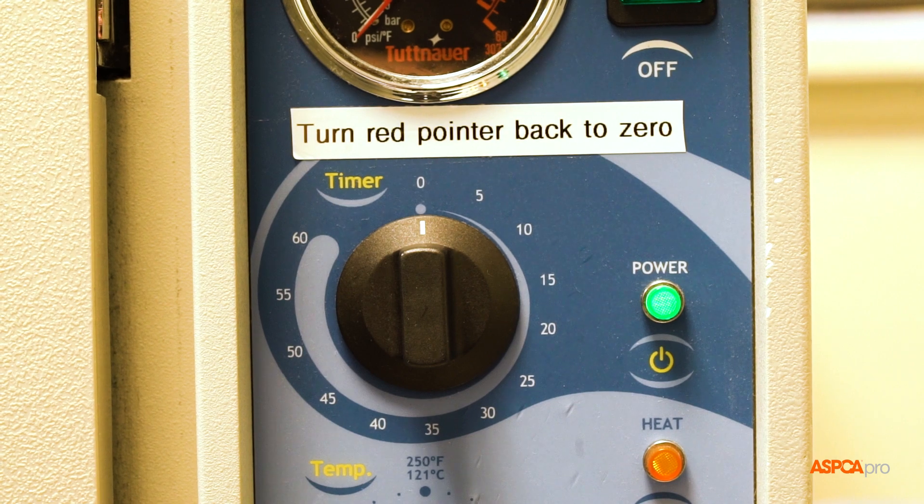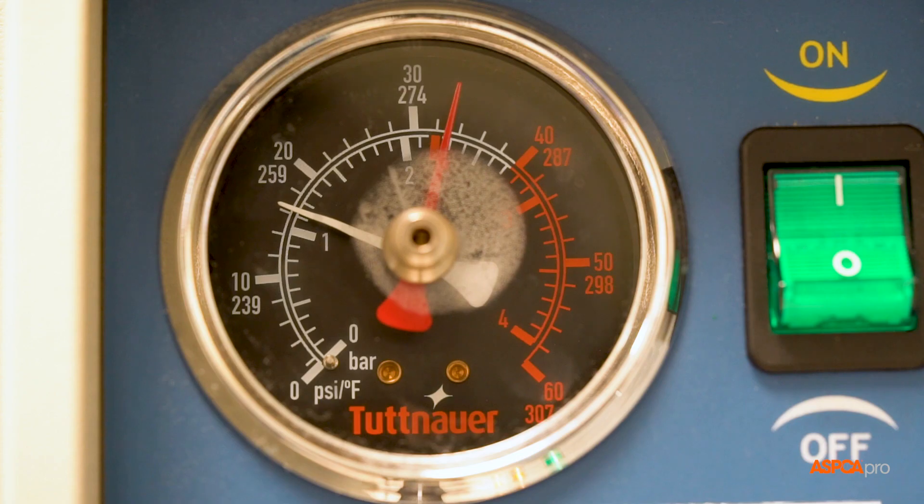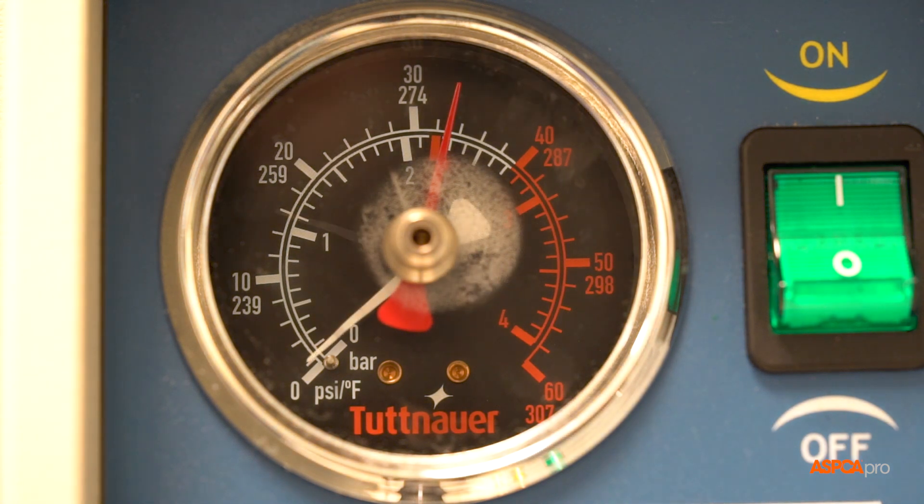Once the timer indicates cycle completion, turn the dial to exhaust and dry, and let it sit until the pressure gauge has returned to zero.